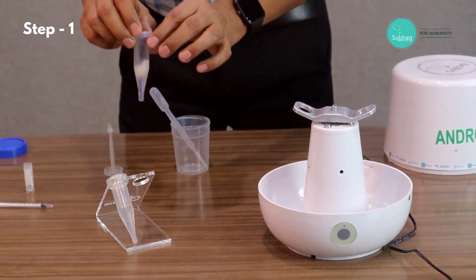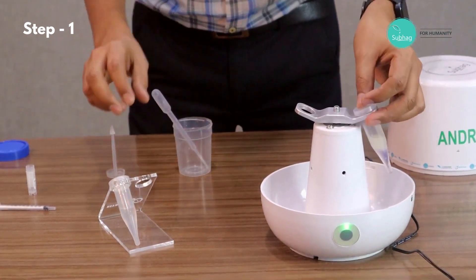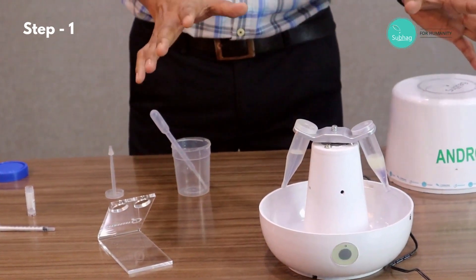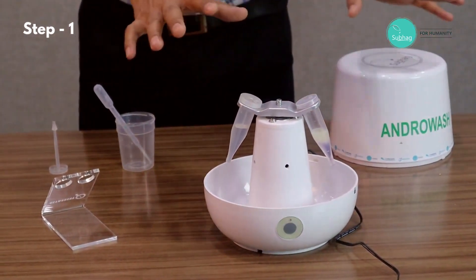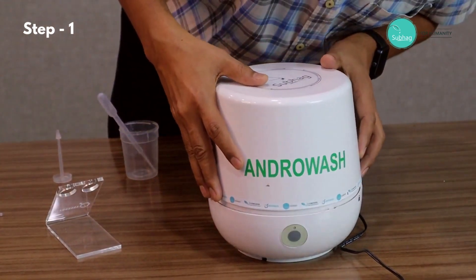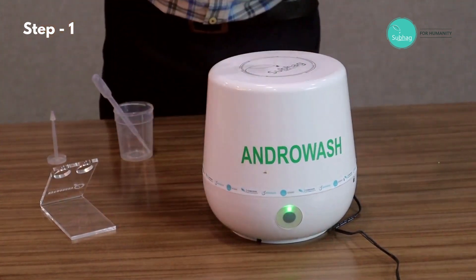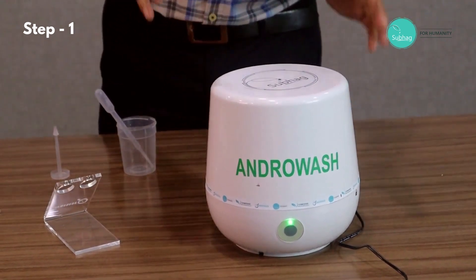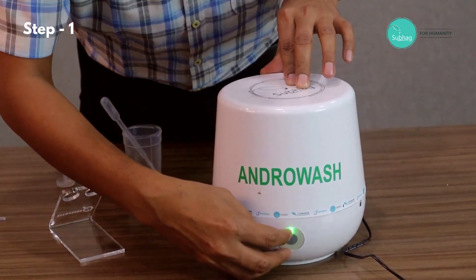The machine is already powered on. We put the tube with the sample first, and then we take the other tube — the balancer tube — and put it into the rotor. There is a safety lock, so unless the cap is put back and locked, the machine will not operate. We put the cap and then lock it. Now it's ready for centrifugation.